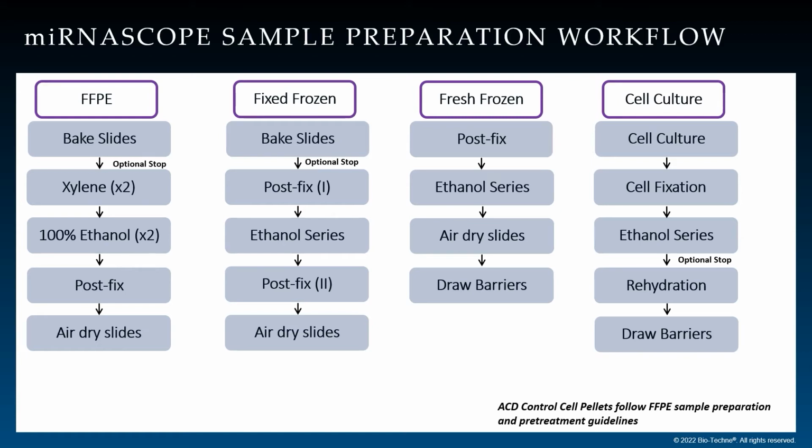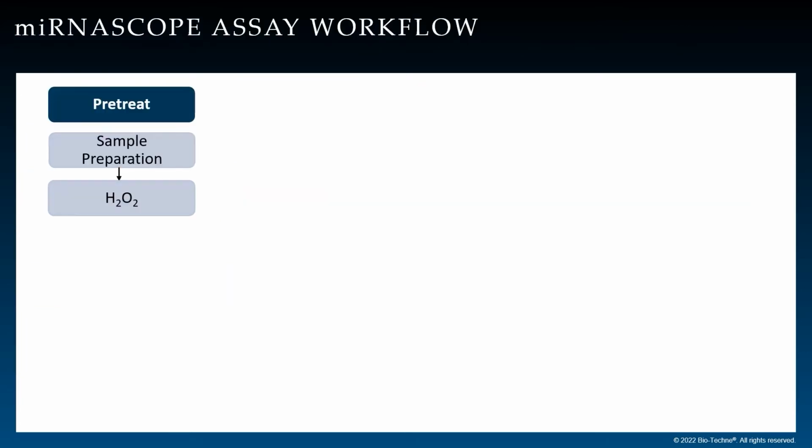Finally, hydrophobic barriers are drawn around the samples. Once the samples have been prepared, proceed to the pretreatment steps. First, all samples are treated with hydrogen peroxide.